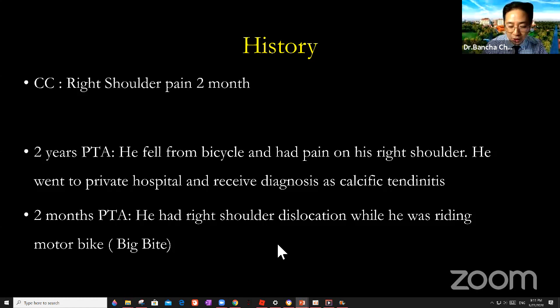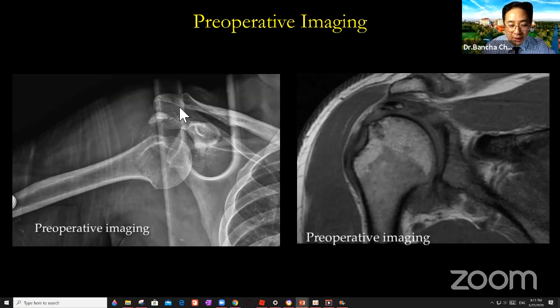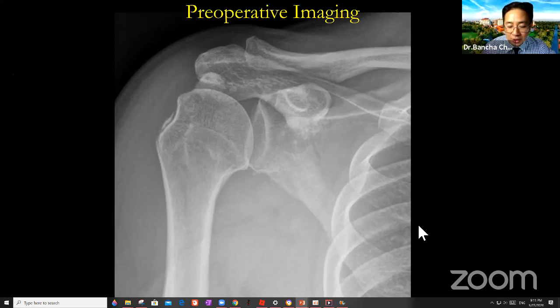So this is his x-ray at the emergency room. He had an anterior dislocation, and you see this piece of bone. I feel that this piece of bone is not acute because the size of the bone is small but the defect is big. I think that should be a chronic GT injury. So this is the film after the reduction. You see that it's sclerotic and this piece is also sclerotic. I think this is a chronic GT avulsion, and the dislocation is because he has no rotator cuff, like a dislocation in the elderly.